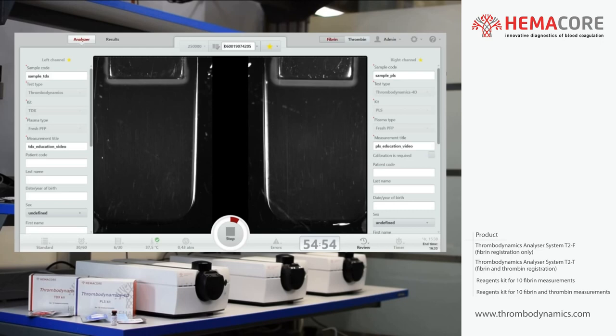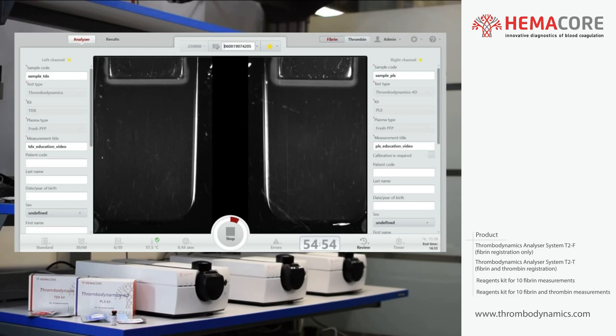The software starts a countdown and shows real-time photos of clot growth for each channel. Segments of the status light ring turn red clockwise as the measurement progresses. After the measurement is finished, the results of the analysis will be calculated automatically. Switch to the results tab to see the list of measurements and the results of their numerical analysis.